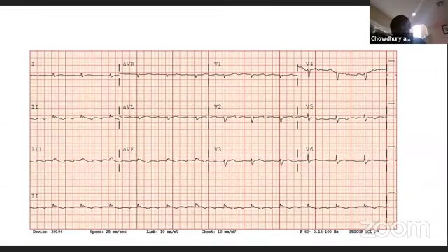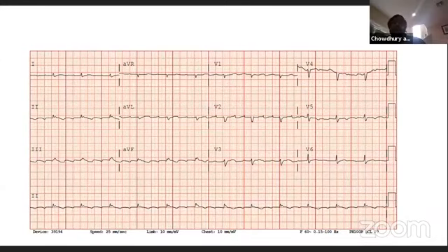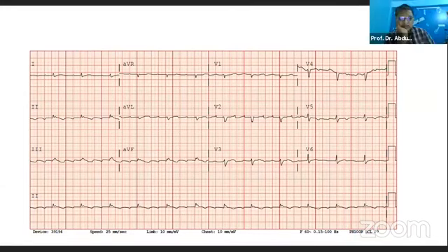So look at the bias between me and Rafiq Bhai. The moment I was reading this EKG, I was thinking flutter, atrial tach, it's semantic, and then heart rate. But I was fascinated with the voltage. Voltage is low. I said, is he in trouble? And the fellow said, yeah, he went into pericardial tamponade last night. So this is very important, that clinical correlation. And this is why we call this forum the ECG basics and beyond.